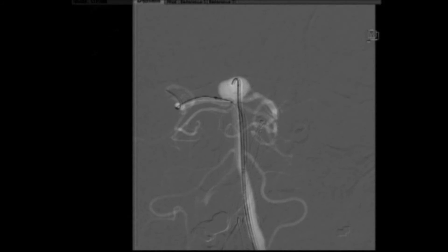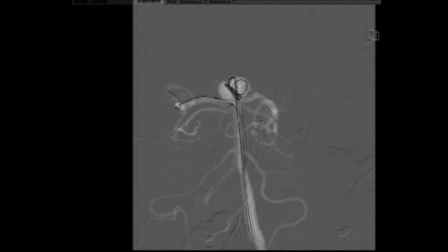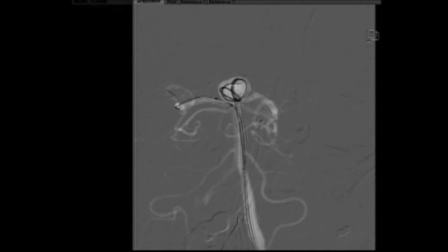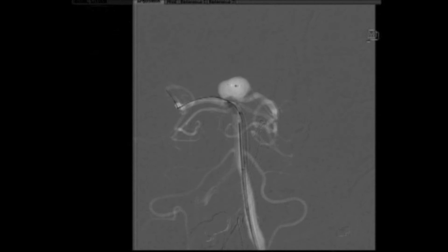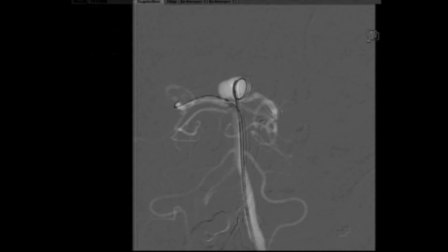Our initial plan was to have a balloon-assisted coil embolization, having a balloon coming from the right vertebral artery and doing the coiling from the left side. We attempted this in multiple opportunities. Since it was a wide-neck aneurysm, it was necessary to have the support of the balloon in the neck. We used a Hyperform balloon that was placed from the basilar artery into the right PCA, and a microcatheter was advanced into the aneurysm, and the aneurysm was attempted to be coiled.